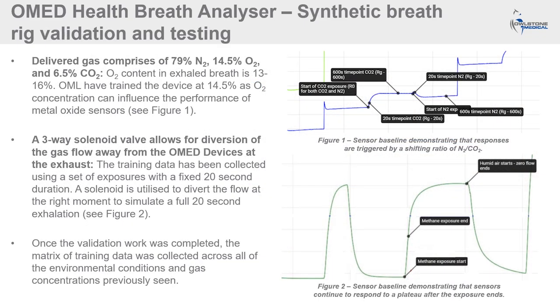The last thing I'll say about the rig before handing over to Riccardo is to detail some of the validation work that we have carried out to ensure that the OMED Health Breath Analyzer is trained under optimal circumstances. The initial version of the rig was designed in line with our set of requirements for the experiments. However, we found over time that there were many different modifications to the rig that needed to be made in order to improve experimental stability and performance.